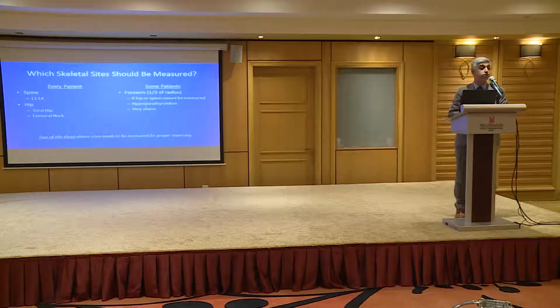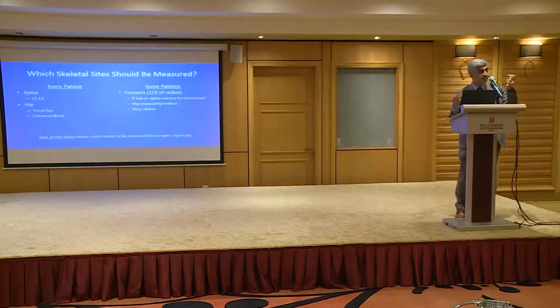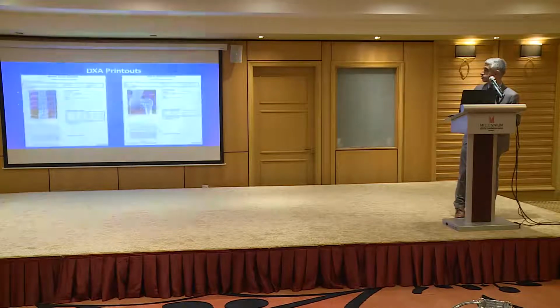In cases of hyperparathyroidism, because the high PTH acts more on cortical bone, and the forearm is about 90% cortical bone, you'll see the effect of the high PTH causing resorption more in the forearm, whereas the spine is 90% trabecular, so it has less action on the trabecular. The hip is kind of 50-50 mixed. So you see more effect on the cortical bone in the forearm. Very obese patients, we already discussed because of this situation of these patients.